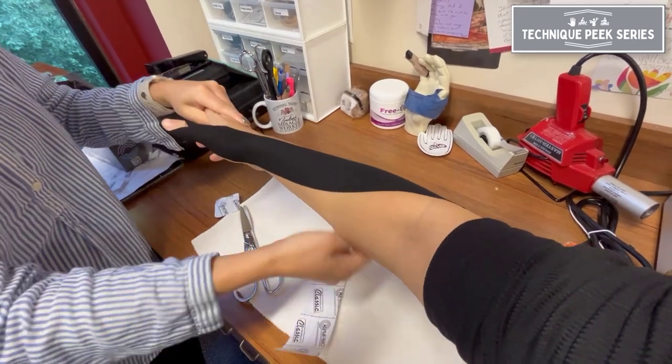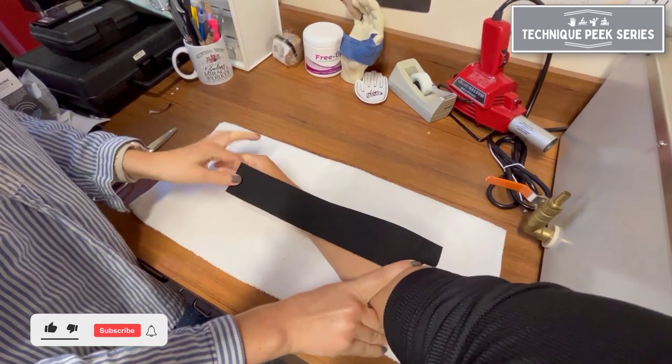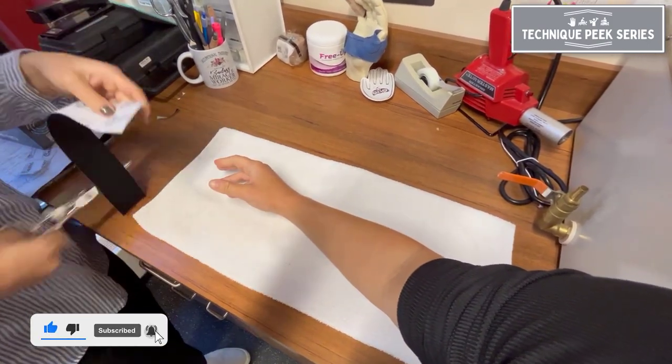Today we're going to go over a technique for extensor pollicis longus facilitation taping. In order to facilitate a muscle, you want to tape from proximal to distal.